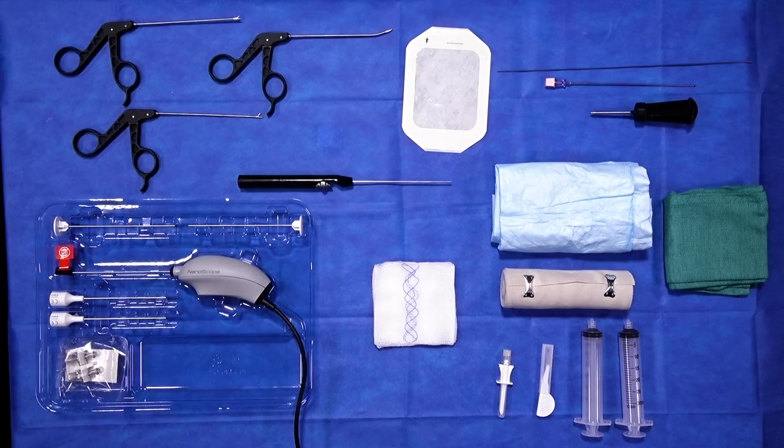I wanted to have the opportunity this morning to demonstrate all what you need to perform a nanoscope here in the operating room or in the office. It's impressive as you can see what's on the table here really lets you take throughout the entire phases of care the little that you need for preparation, then the camera and even the equipment here for instrumenting a knee or a shoulder or other joints.